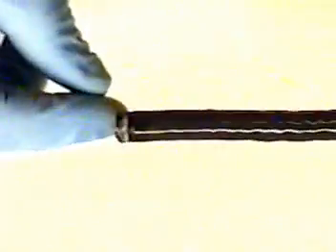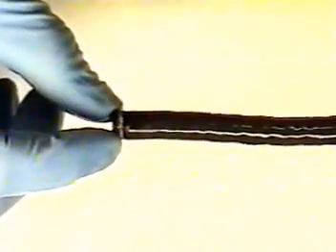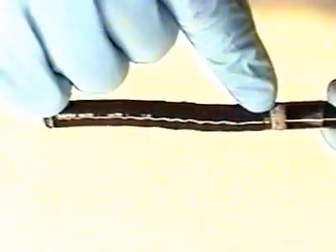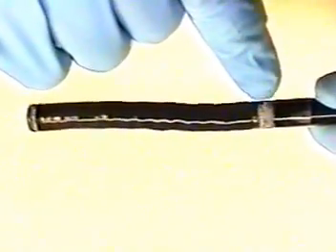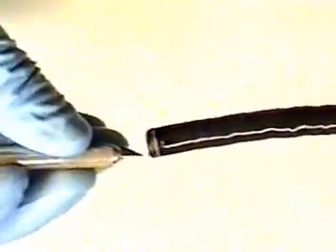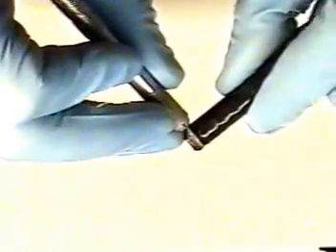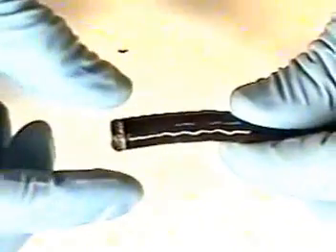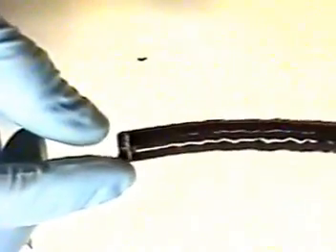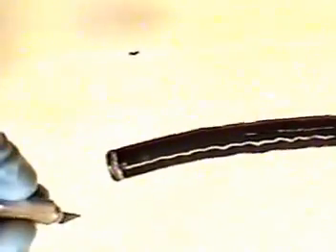We now have a nice clean binding and bending sheath flush up against the distal end or C cover, and a nice tight binding up against the insertion tube and old glue joint. If there is any excess bending rubber, please cut away with knife. If this is not cut clean, when we glue each bending joint and binding, it will poke through the glue.